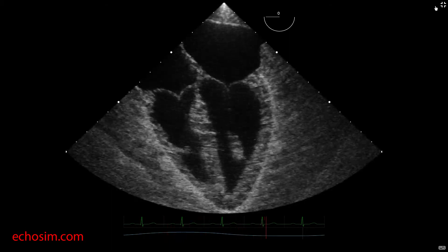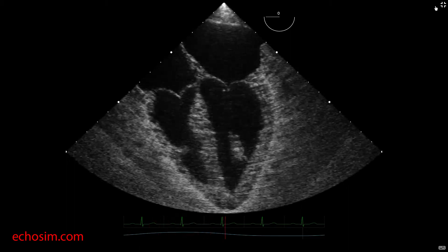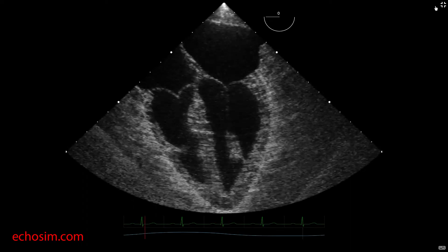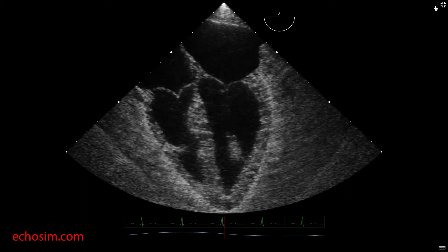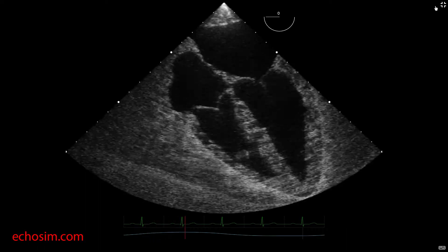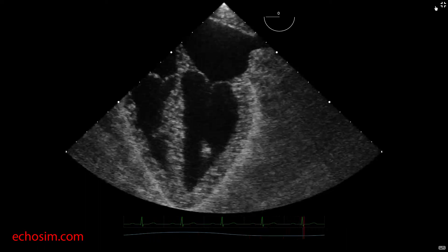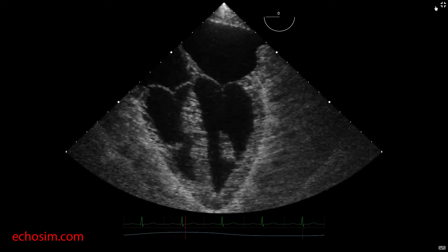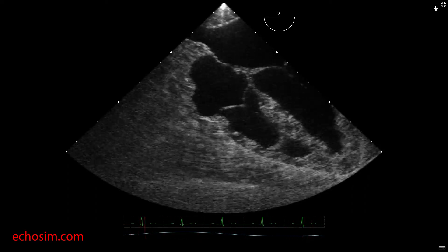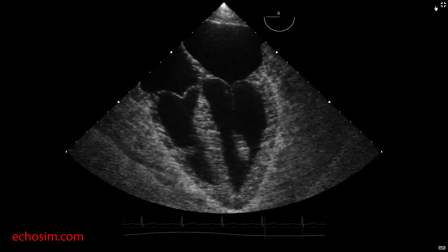Once the mid-esophageal four-chamber view is achieved, both the left and right heart can be brought to center screen by simple clockwise or counterclockwise rotation of the probe, as seen from the perspective of the operator. A clockwise or right turn will demonstrate the right heart on center screen. A counterclockwise or left turn will demonstrate the left heart on center screen.